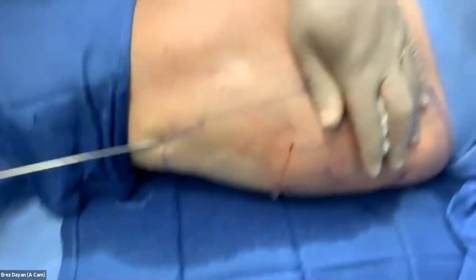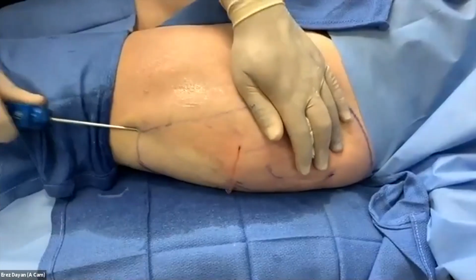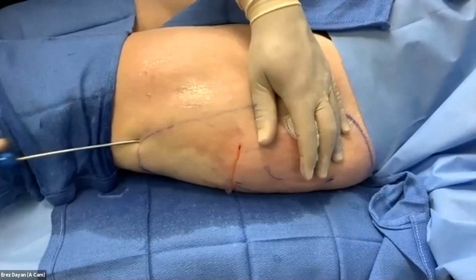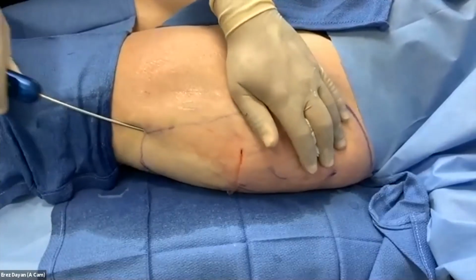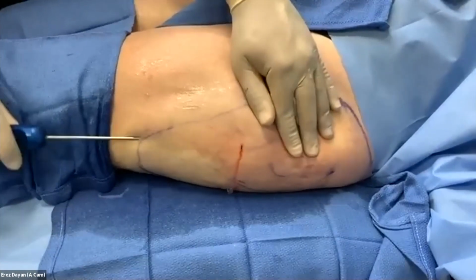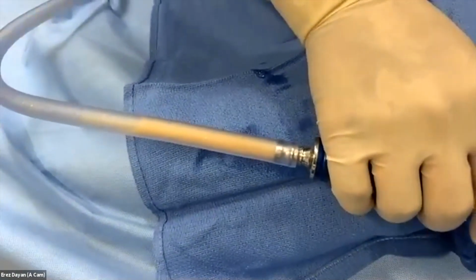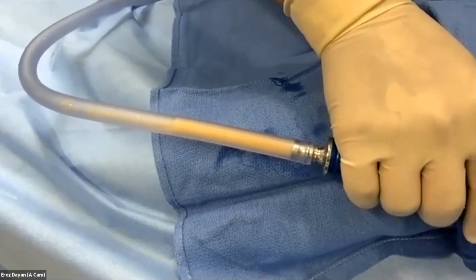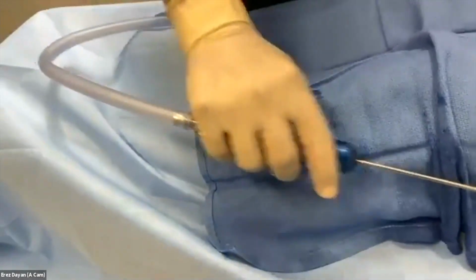So this is a case where I could just do lipo and it would be fine. I believe it would contract well, and I think she would have a nice result. The radio frequency is kind of additive. So you see the lipo technique, a lot of you guys do lipo, so I don't need to tell you, you could probably teach me about it, but I'm moving around more, I'm fanning. You feel any of that? Good, so she's totally comfortable. Again, straight local. You'll notice there's no blood. This is a coagulation device, so you're not really causing bleeding. I don't even worry about bruising because you usually don't get it. So the fat's usually very clean.